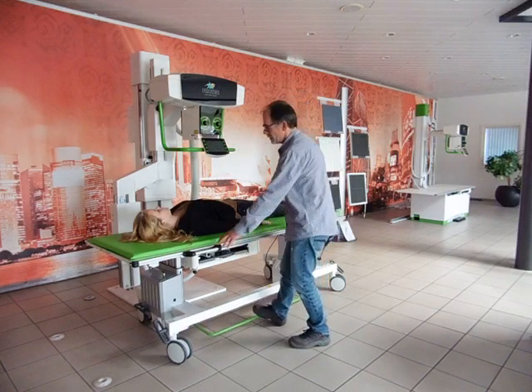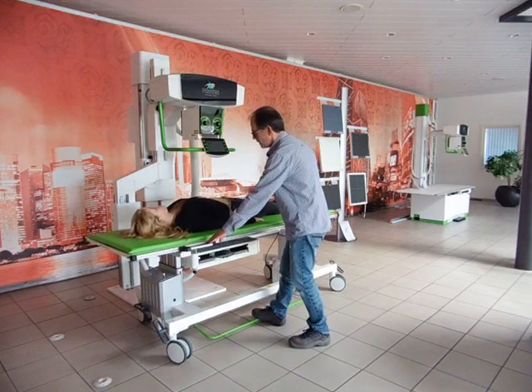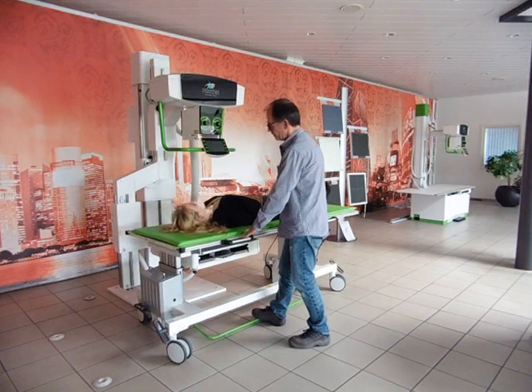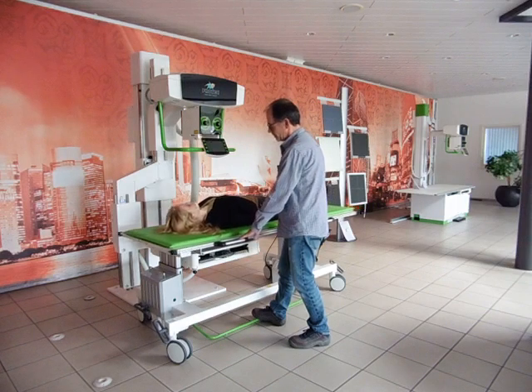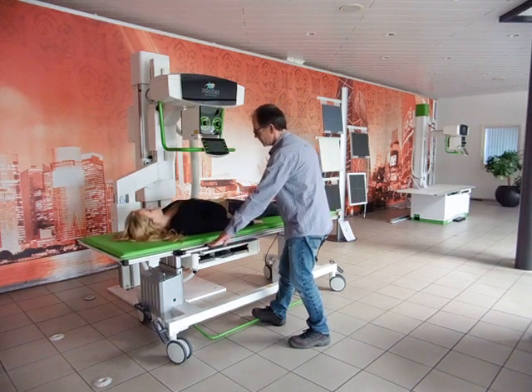You can do all exposures with the table by adjusting the floating table top — lumbar spine exposures, even head exposures, and of course extremities as well.